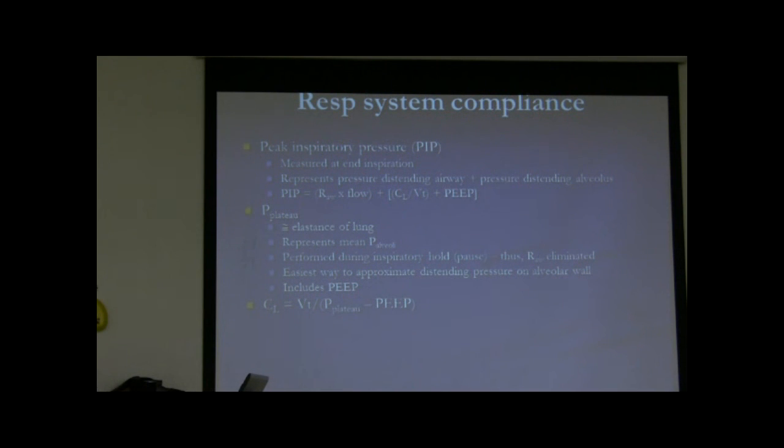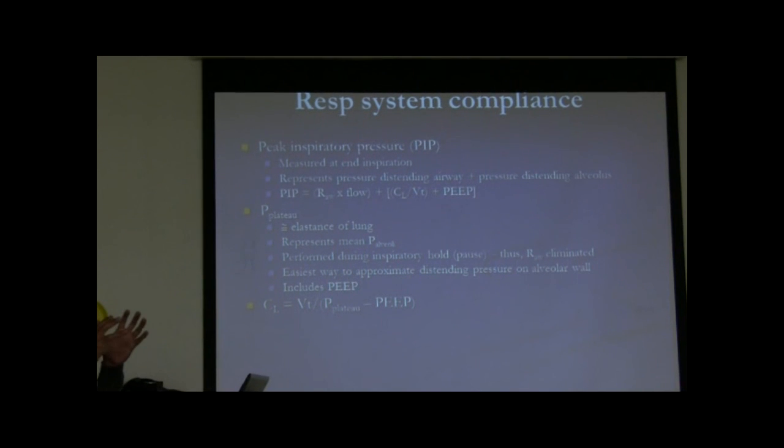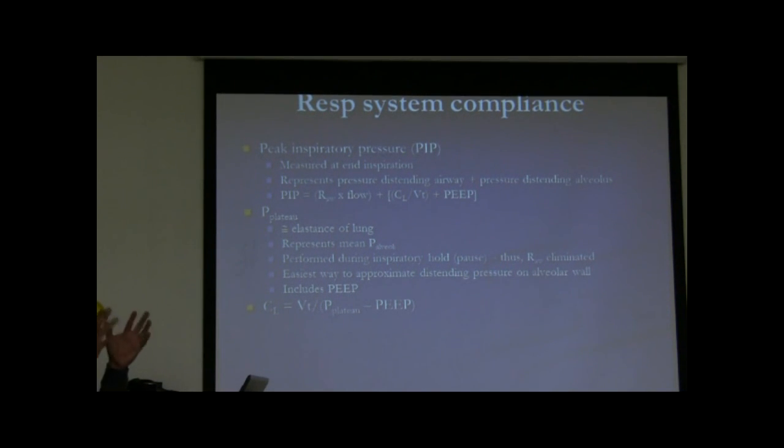It's just a classic volume pressure curve. All right? So here you have it. The compliance is basically volume over pressure. So for a certain amount of volume, it depends on what the pressure is to generate it. If you have a very stiff balloon, it's going to take a lot of pressure to get that same amount of volume into the balloon, whereas if it's really wispy and really moth-eaten, then it's going to take just a little bit of pressure. Okay? Yes?